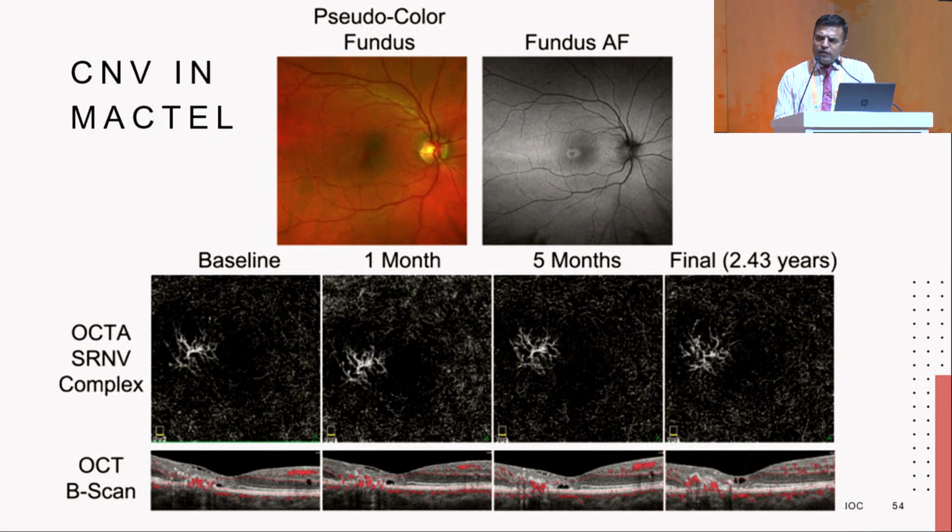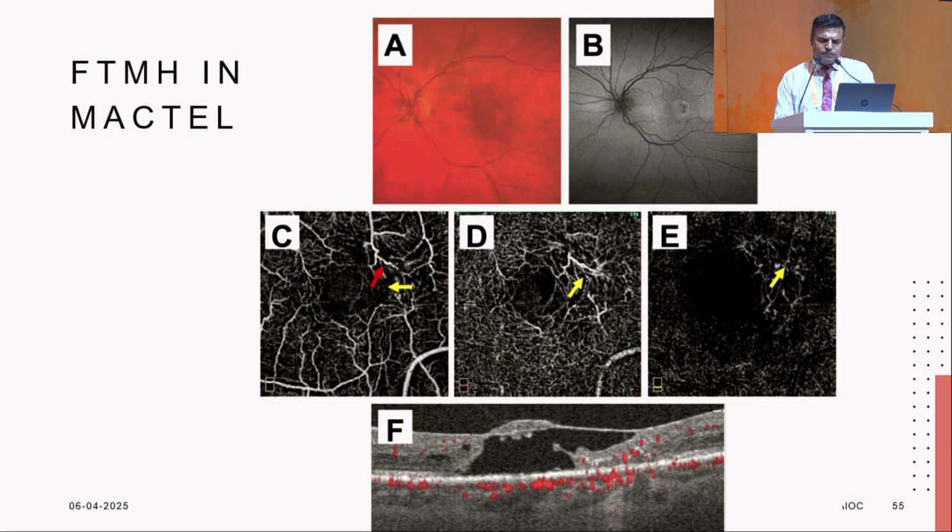Similarly, choroidal neovascularization can develop in macular telangiectasia. We have seen cases on record where a MACTEL has been erroneously labeled as a PCV and been treated for almost 2 years with 20 odd injections. On the other hand, in a follow-up case of macular telangiectasia that developed a CNV, it was treated with anti-VEGFs and the disease remained stable for about 2.5 years as reported. Also, if you have a full thickness macular hole with degenerative changes, one should do an OCT angiography to document that this is a neurodegenerative disease and the patient will have a poorer outcome after surgery.